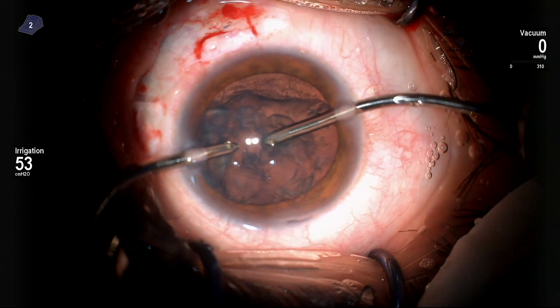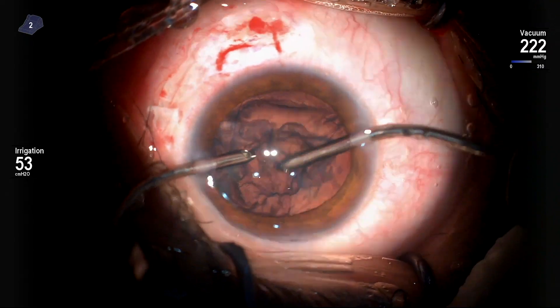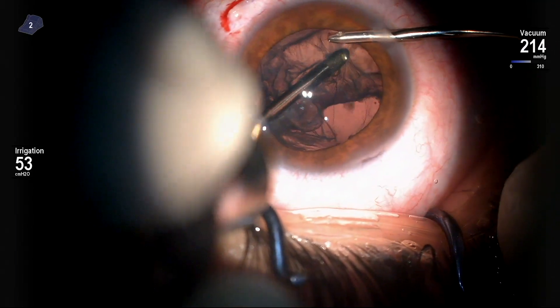Cataract removal was then commenced very slowly and very gently. The irrigation was kept quite low and the vacuum also very low. The lens was soft, so it was done quickly.